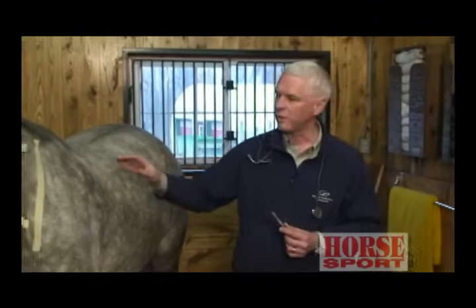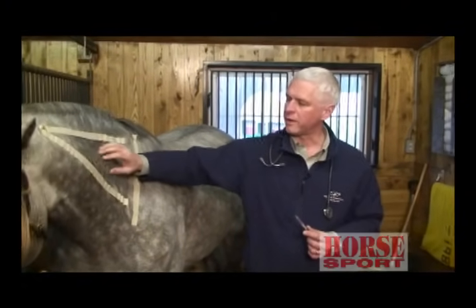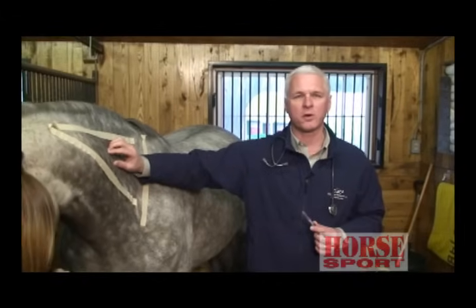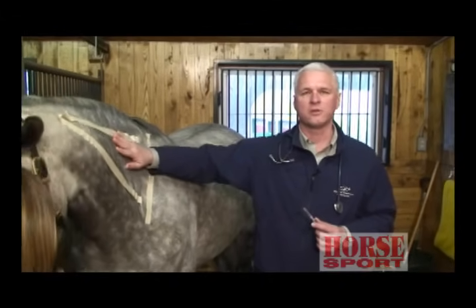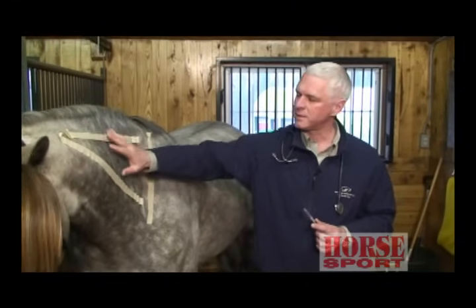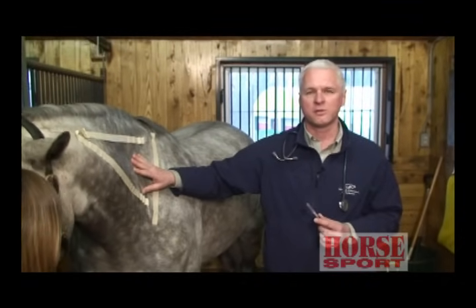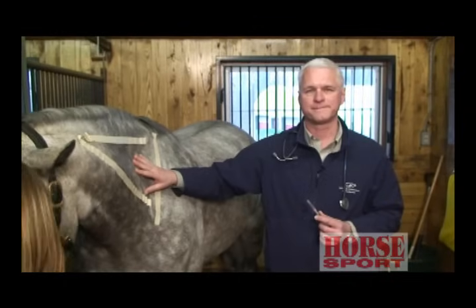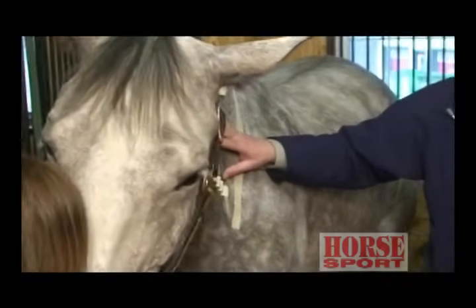Whenever you're giving an injection in the neck, you want to make sure that you don't see any lumps form afterwards or areas of heat. If that's the case, you do want to call your veterinarian to come back out and check that everything is okay. Otherwise, injections in the neck, if you follow these steps properly, should cause you no problems whatsoever. Thank you very much.